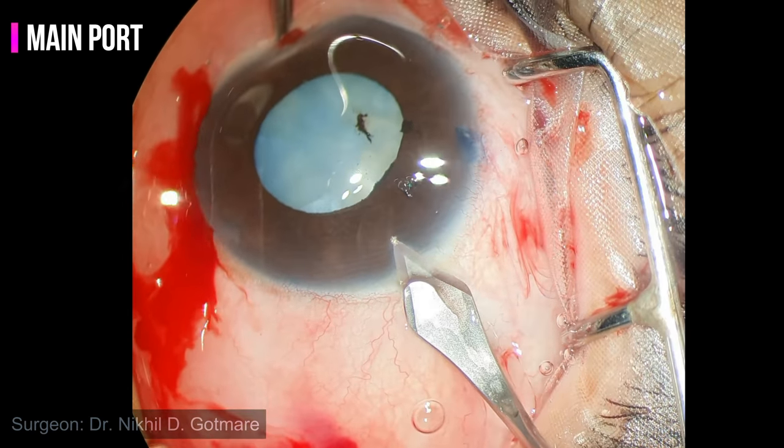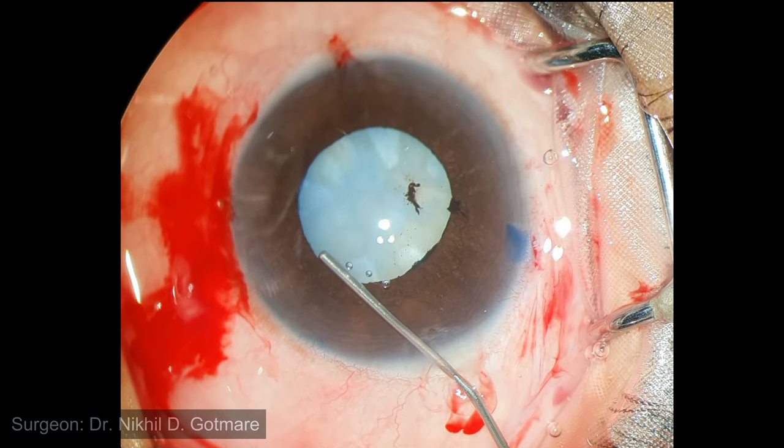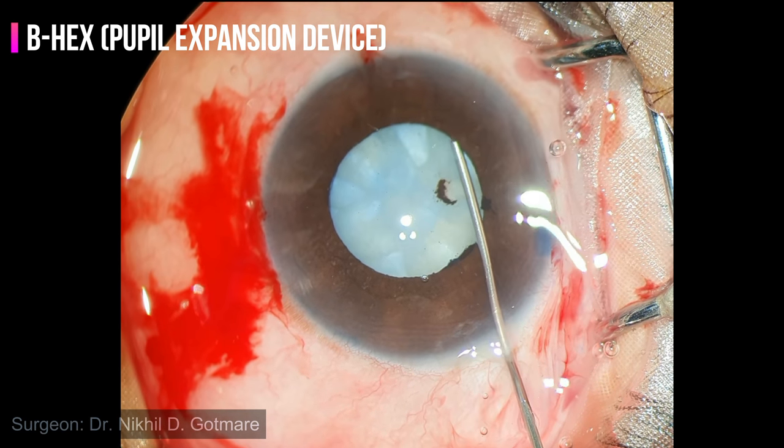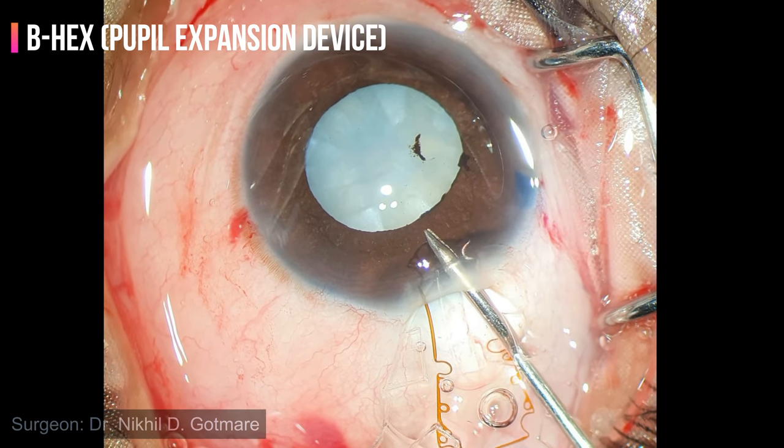The main port is created using a keratome. Viscoelastic is injected under the pupillary margin to make space for the B-hex ring. The anterior chamber is kept underfilled, as overfilling will push the iris against the anterior capsule.